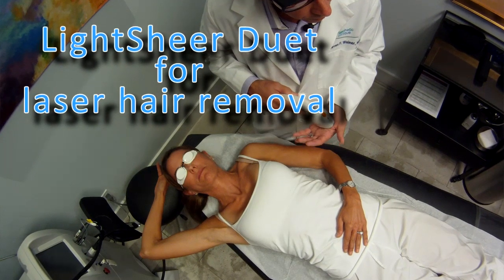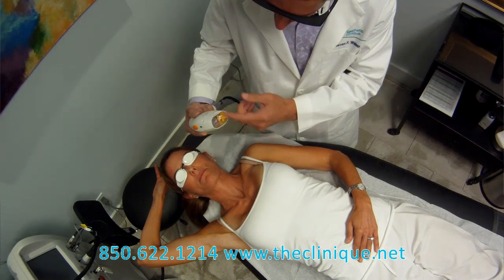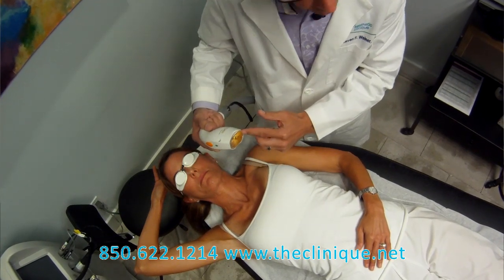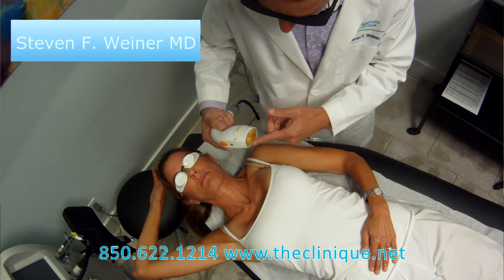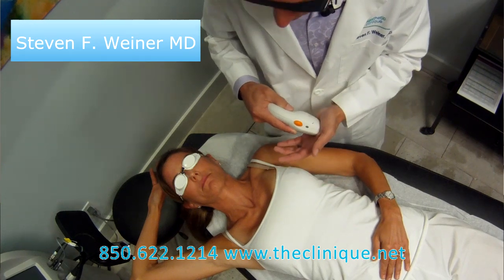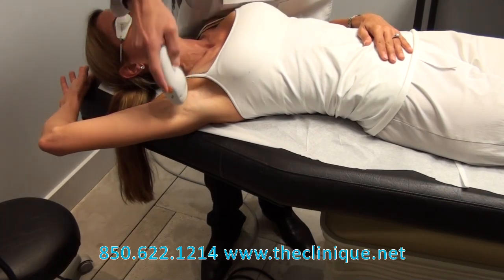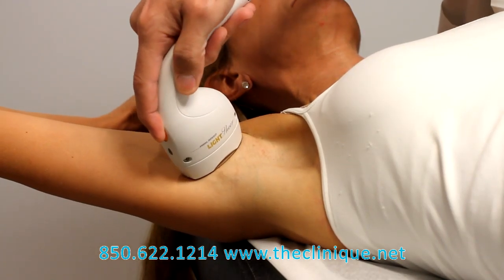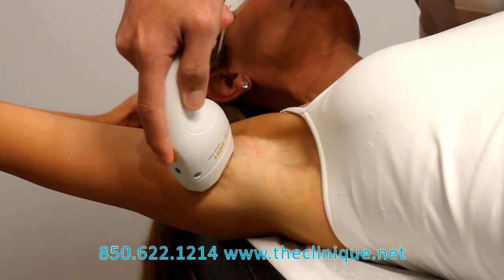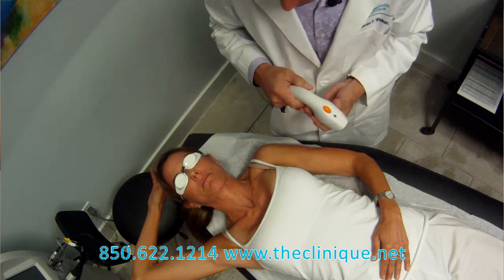What I'm demonstrating here is the Lightshear Duet. This is the high-speed handpiece, and what it has is an integrated pneumatic device which pulls the skin in closer to the laser. It treats a much bigger area than the other handpiece, and by pulling the skin up, it makes the procedure a lot less painful. I'll demonstrate the entire underarm treatment, which I can do in about 10 to 15 seconds. There we go — simple as that. That's an underarm treatment with the Lightshear Duet.